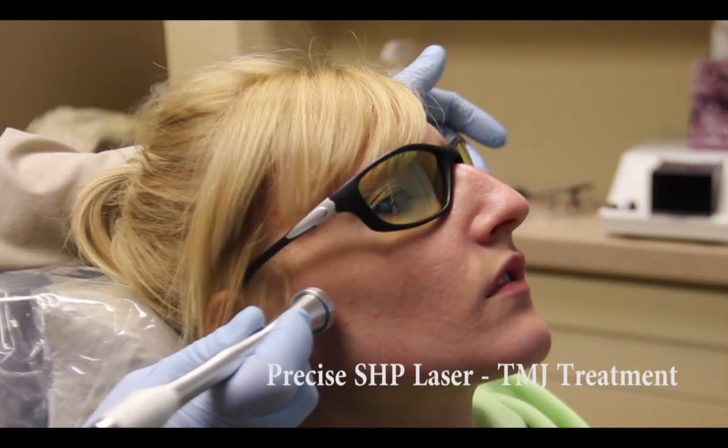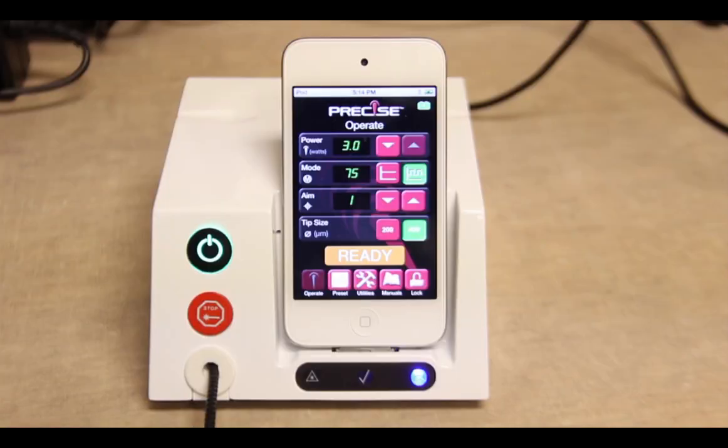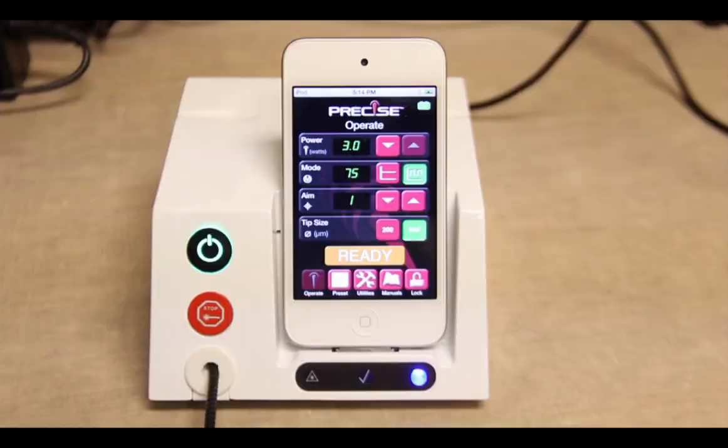In this clinical laser video, we're going to utilize the SHP precise laser to help treat TMJ and muscular pain in our patients. Many times our patients come in complaining of joint pain or muscle pain. In this video, we'll use three watts with a 75 percent pulse setting.